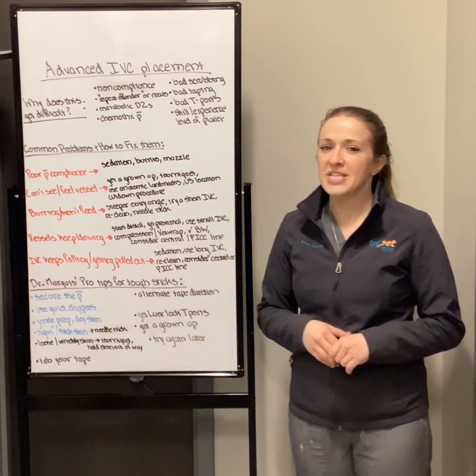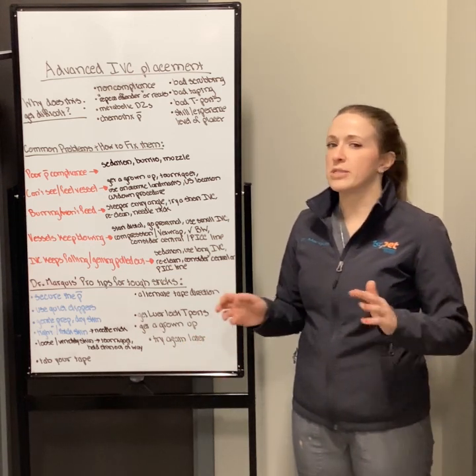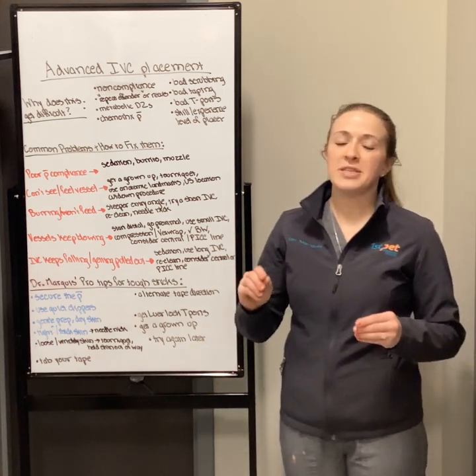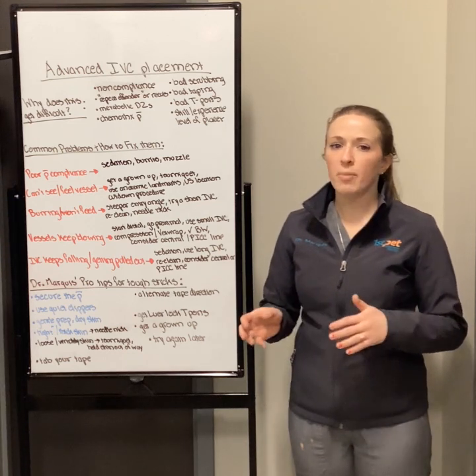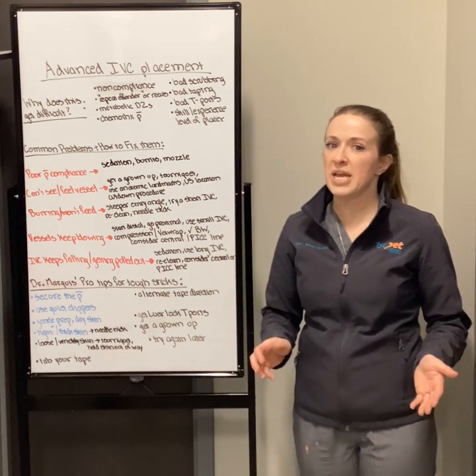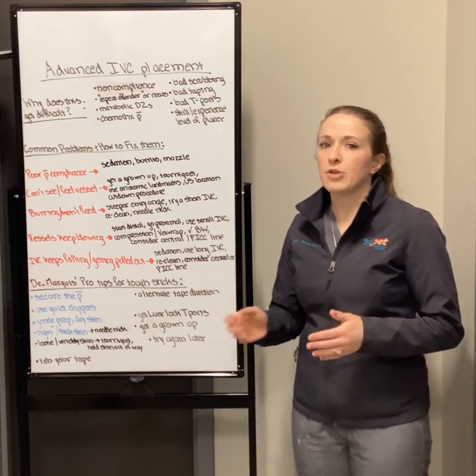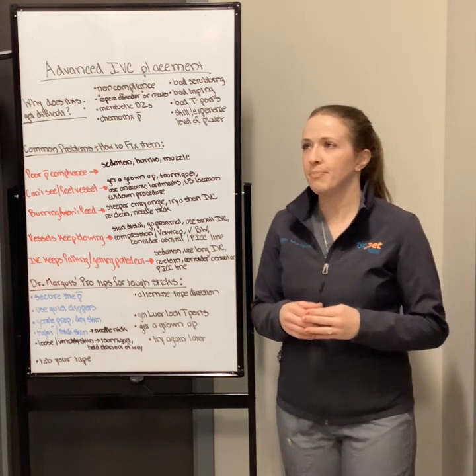So there are tons of reasons in the hospital or on the clinic floor that we have a catheter placement that's not going so well. It was tricky to do, either the patient was tricky, or there's just some issues with getting the catheter into the vessel. So today I want to talk about some of the most common reasons that catheters can be difficult to place or difficult to maintain, some of the things we can do to get around those issues, and then a couple of my pro tips for easy catheter placement and some techniques that you can try at home.